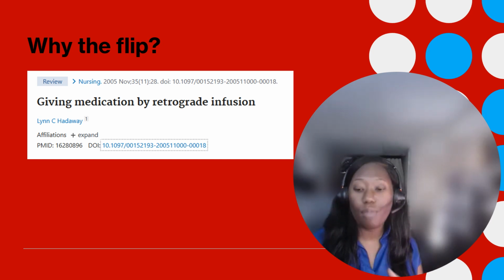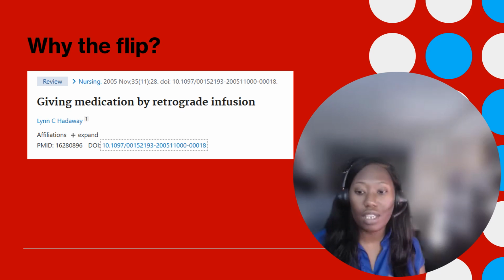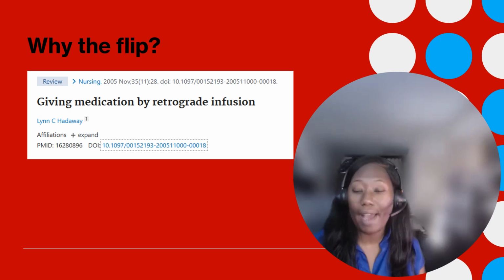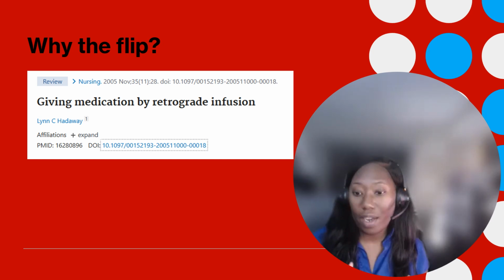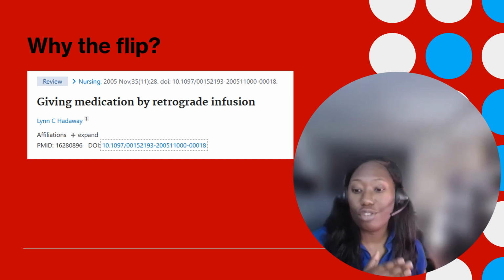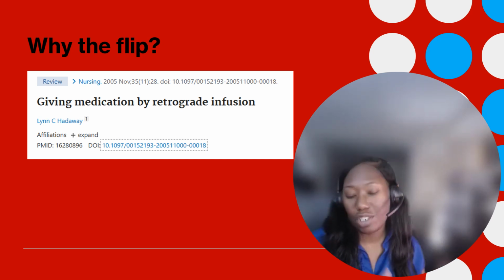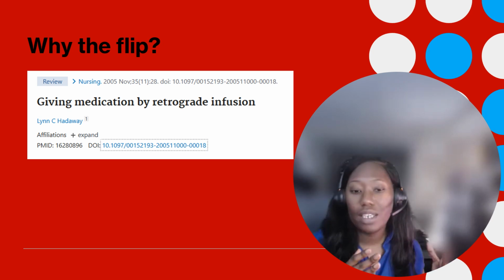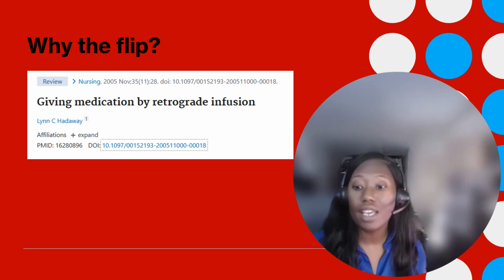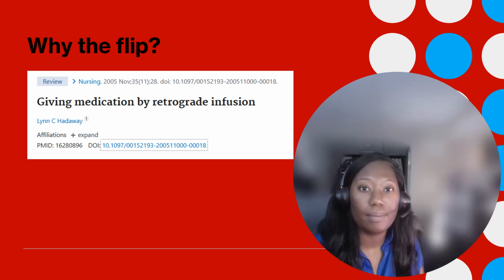This is a practice that can be used in a very special situation for neonates when you have to give them a volume dose of about 1 ml or less. This can be an alternative way to infuse that type of medication in the neonate population. But again, not for adults, so not something that we can just take and use for regular practice.